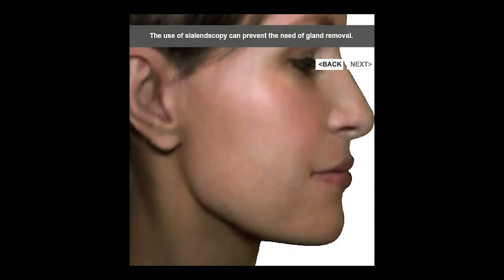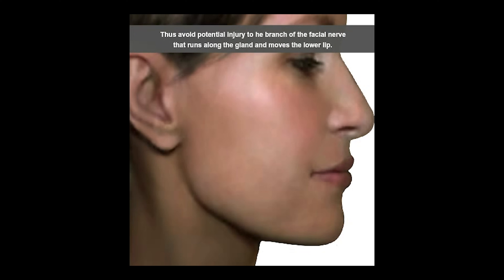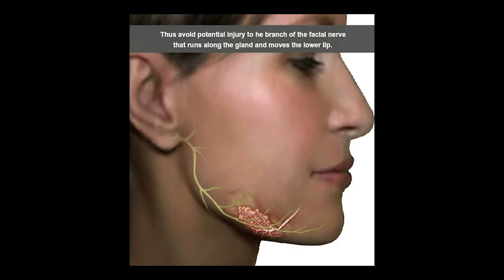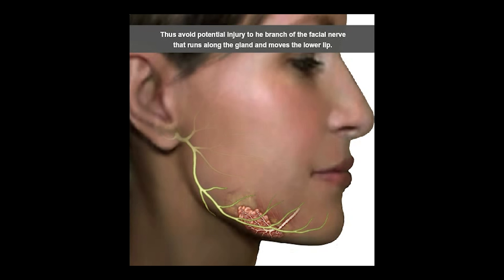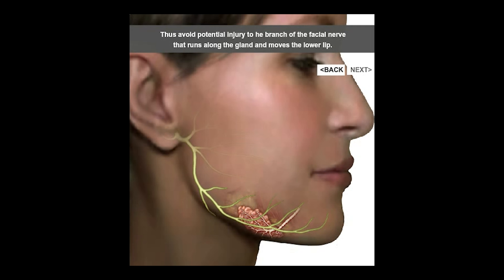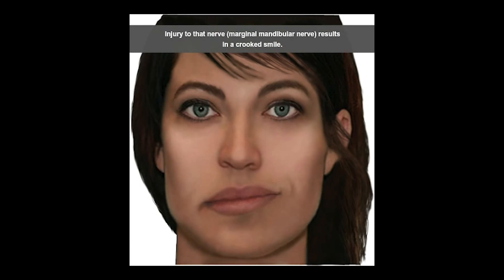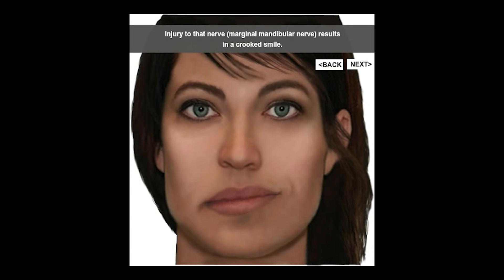Sialendoscopy allows you to avoid removing the submandibular gland as a whole. Removing the submandibular gland puts the marginal mandibular nerve at risk of being injured — this is the nerve that moves your lower lip. If you were to injure that nerve, you would have a crooked smile, as shown here.